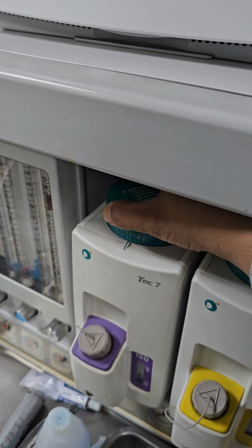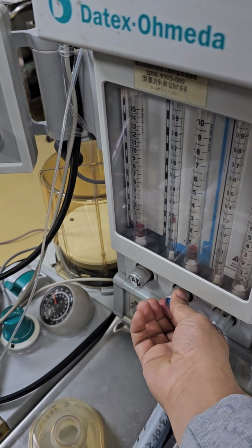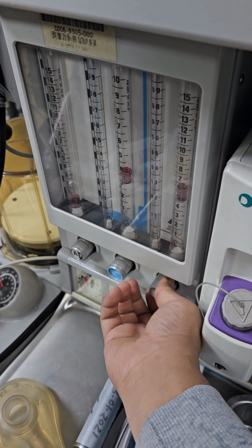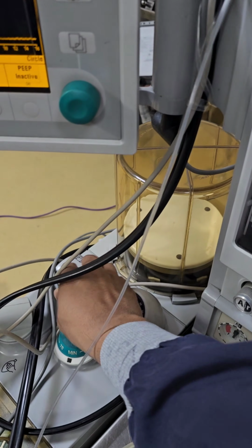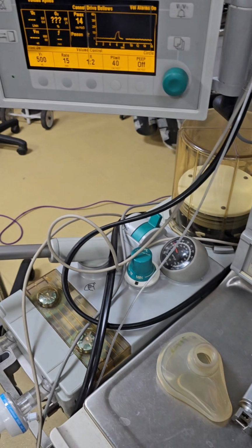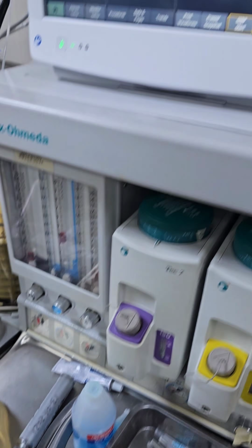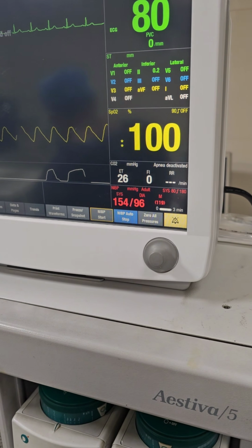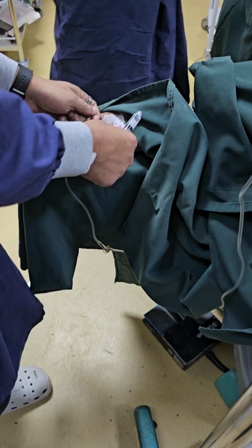Now we started the isoflurane and adjusted the oxygen and nitrous oxide as the carrier gas. After that we are going to start our ventilator. The bellows is low, so we flush some oxygen to fill the bellows, and we are seeing the ETCO2, and it confirms that the endotracheal tube is in the perfect place.